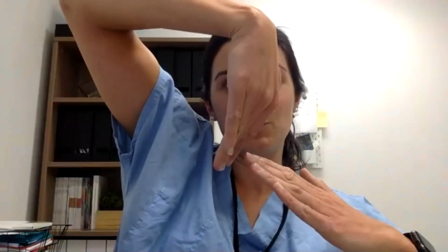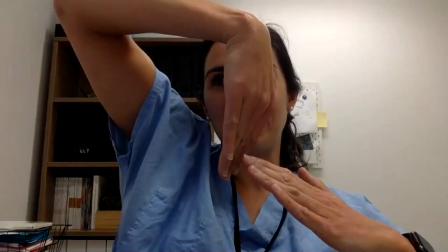That's a good idea. So once you're in the cords, Kovacs, the guy from Halifax, mentions that sometimes when you don't have the right approach angle, you're a little bit too angulated when you're going to enter the trachea. One of the tricks is actually to rotate a bit. When you're rotating, you have a better approach to drop your tube and really be able to fully insert it in the cords.